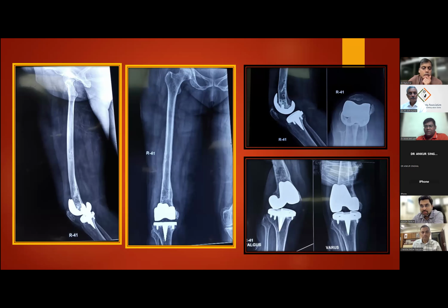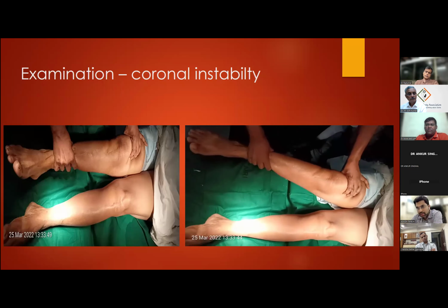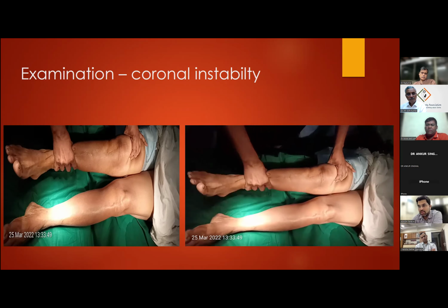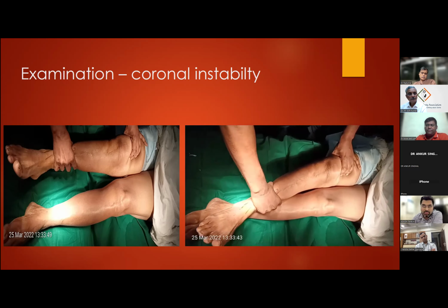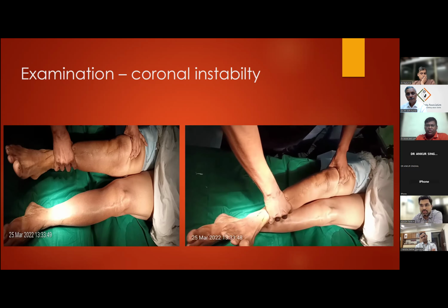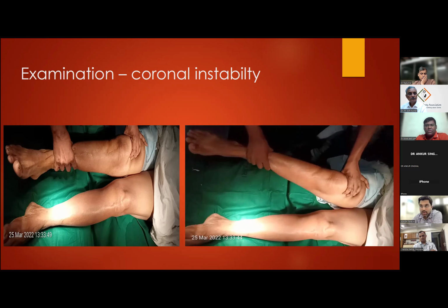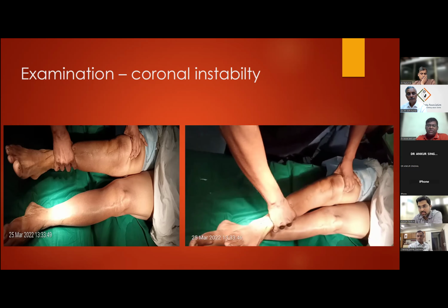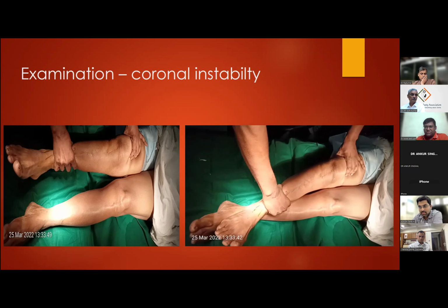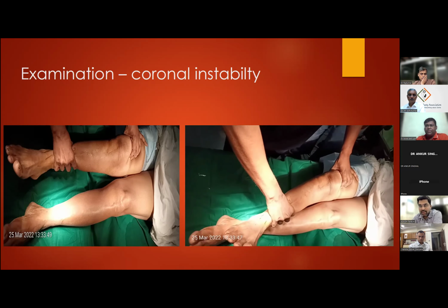Yes, please go ahead. The next issue at hand will be the different incisions that we have. So probably we'll have one midline and one lateral incision, and they should be adequately spaced. Already 2 years have elapsed. And what about the bone loss? We are anticipating that this patient needs revision, and there will be a bone loss during the revision after removal of the prosthesis. So you'll be keeping all the armamentarium as you've discussed. Yeah. So let's proceed.